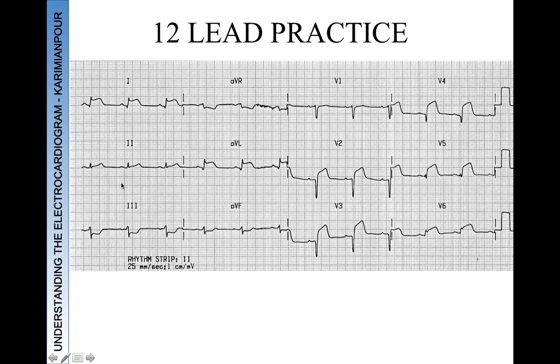We talked about our axis, and how it's positive in limb lead 2 and slightly negative in aVF, so it makes us think there is a slight left axis deviation, although it's most likely within a normal quadrant. Then we jump to the obvious thing on this ECG, and that's that there are ST elevations in the anterolateral leads. In V2, V3, V4, V5, and V6, there are ST elevations. They're convex in morphology, the tombstoning ST elevations you typically see.